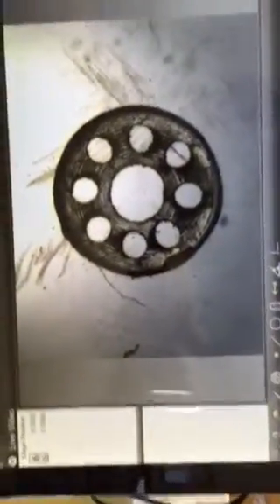All right, so here's where we have the Kinetic with a multi-lumen tube. I don't know what the model number is, what the part number is for the tubing, but it looks like this. So this is what the screen sees right here.